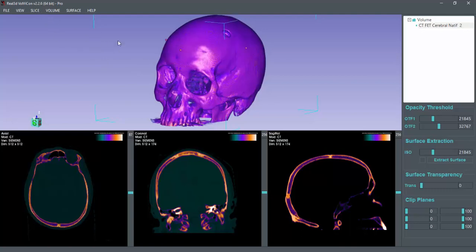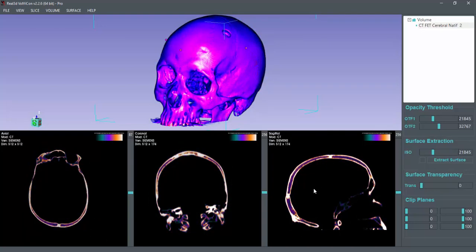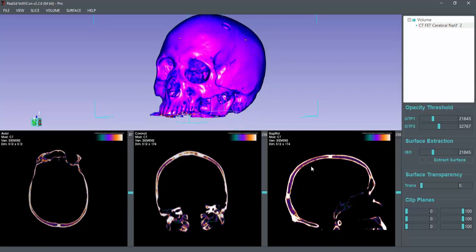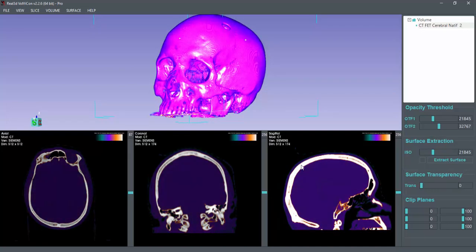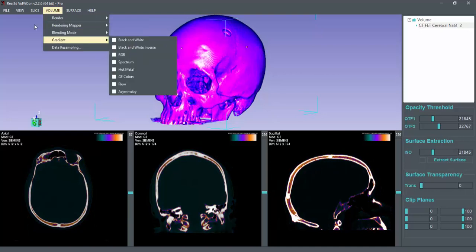First of all, you will notice that when I change the window and level on the slices views, the change will appear in volumetric data. So now you can actually change the window and level of volumetric data.